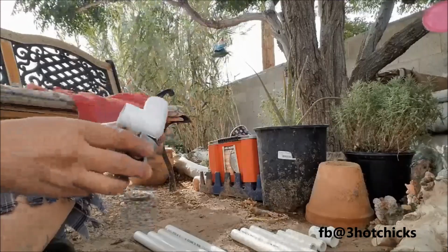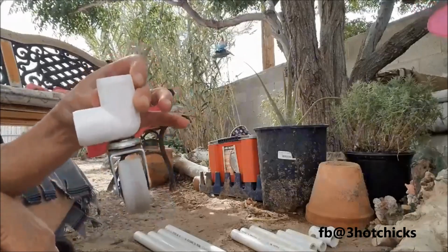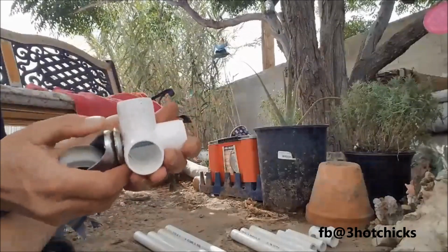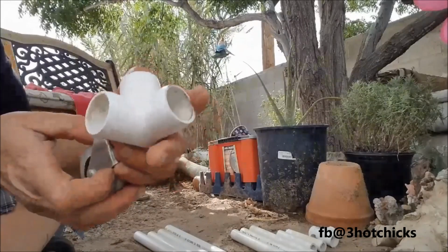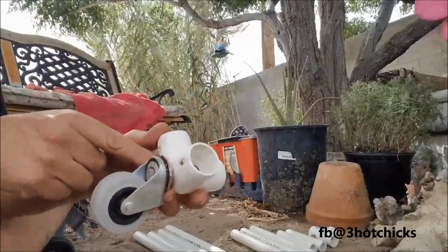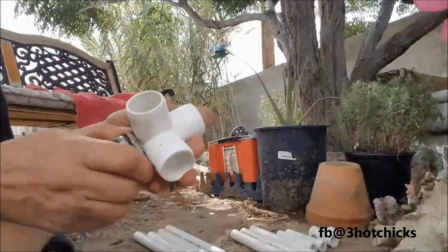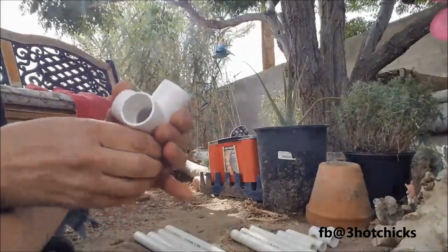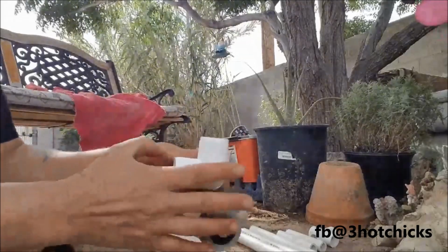Okay, so my 4 bottom pieces that have the wheels on them are 3-way fittings, like that. And then what we did, I can't take the wheels off, but you see they're a screw top castor wheel. So what we did is we just drilled a hole in the bottom of the PVC, smaller than the screw of the castor wheel, and we screwed it in. And you can see it's tight in there. So I'm going to take my fittings and I'm going to hook up the bottom of the wheelchair.